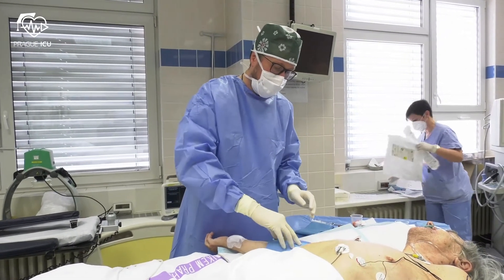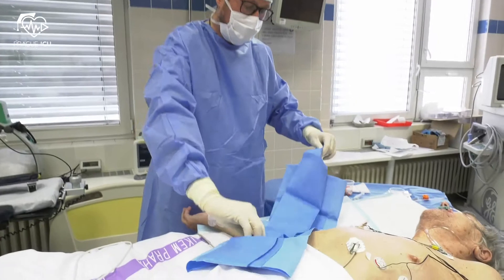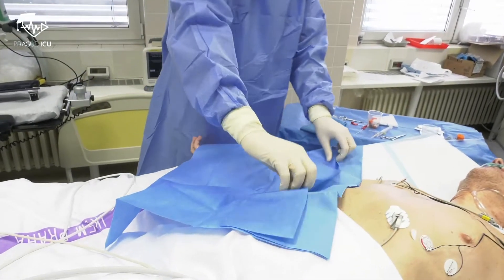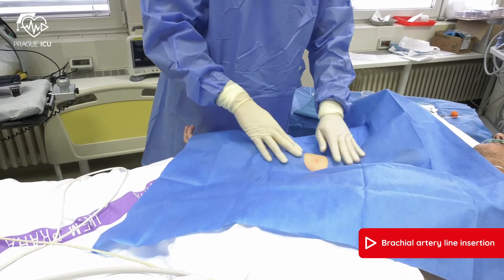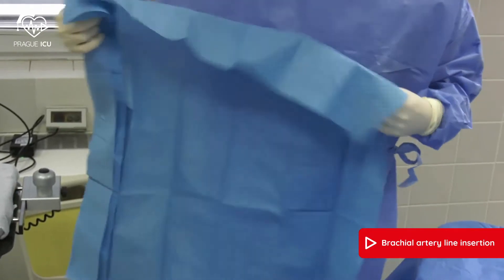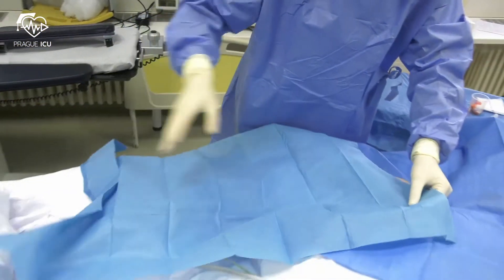Once that is done, we drape the patient. We use a fenestrated drape first, with your mark in the center of the window. The second drape is used to set up a nice big sterile area.